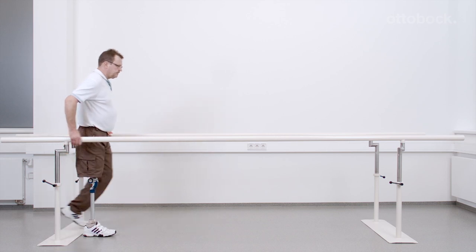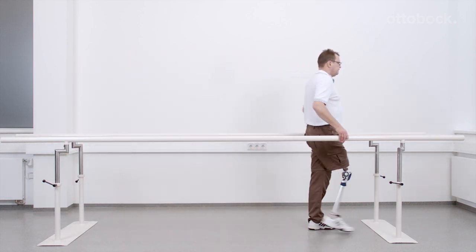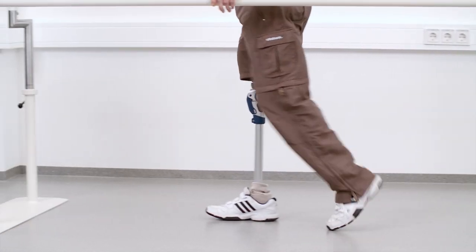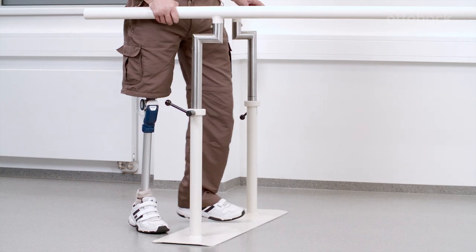A spring tension that is too high, like the one shown here, means that the knee joint reaches the extension stop with too much force. The spring extension is reduced a bit once more so that the prosthetic knee joint is in a comfortable and completely extended position again when it is loaded.